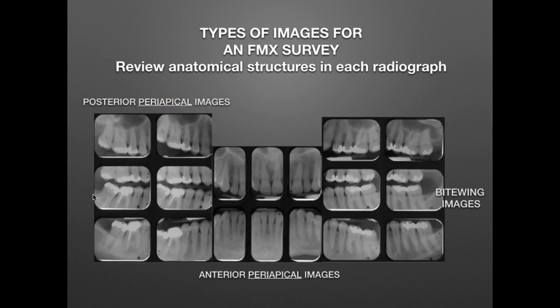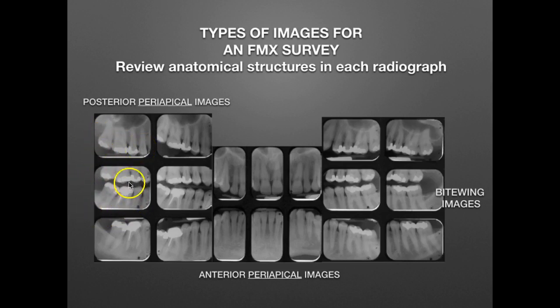Reviewing our bitewing images, we have the teeth in occlusion and we can see anatomical structures much like the periapical images: the enamel, the dentin, the pulp chamber, the pulpal canal. We see the bone level in both the bitewing and the periapical image, and with the bitewing we see the maxillary and mandibular teeth in occlusion. Moving to the anterior periapical images, we see the entire tooth from the root and apex to the crown.